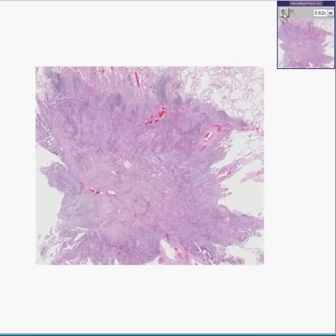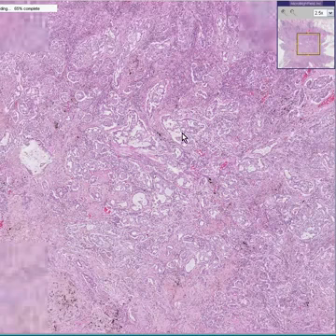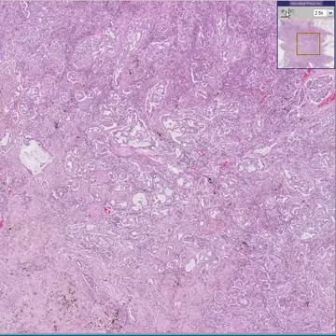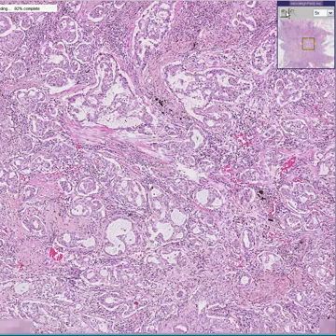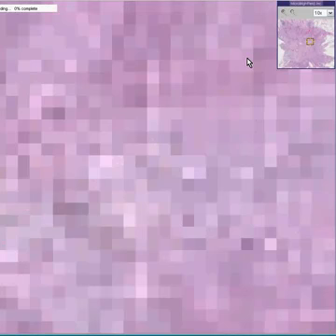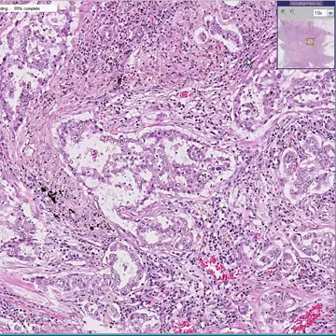So in 2 clicks, we'll find out what it is, because we can see that this tumor is forming nice little glands, even at this power, very easily, acini basically. And also, in all honesty, again, do we know whether this adenocarcinoma started out in the lung as a primary tumor, or whether it's metastatic from a glandular epithelium somewhere else, like GI or practically any place? We don't know. We could do tumor markers, perhaps, and if we found some specific antigens on these cells, which are only found, let's say, on pancreas or whatever, then we could say that it was. But that doesn't happen very often, and usually it could be a tough problem, and it's not always easily solved.